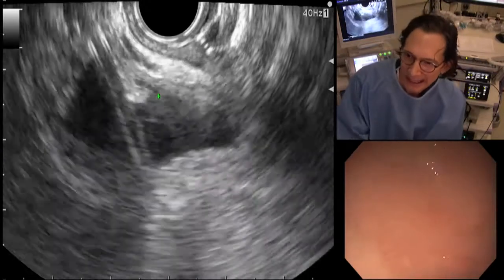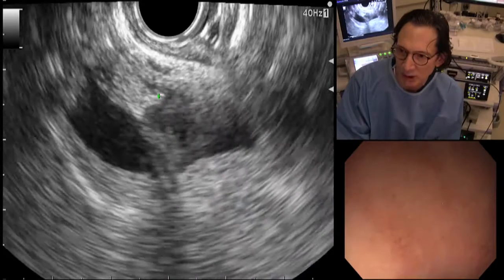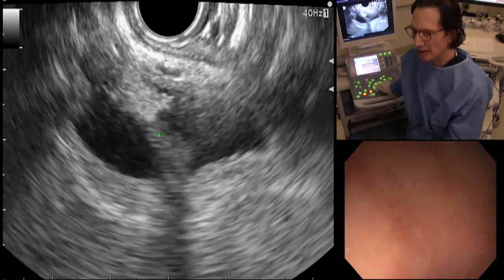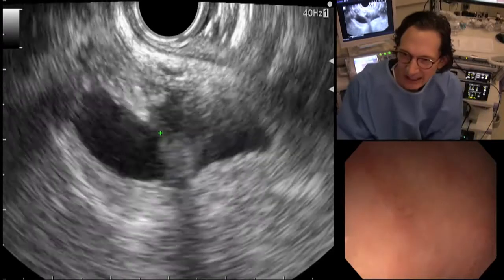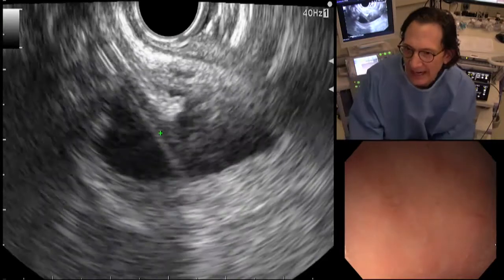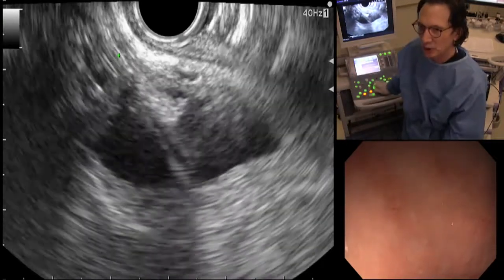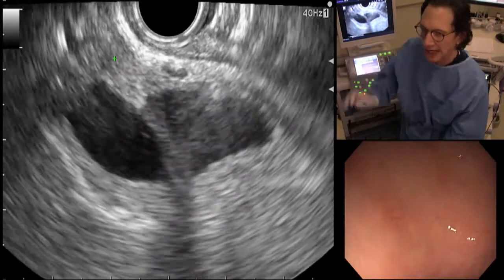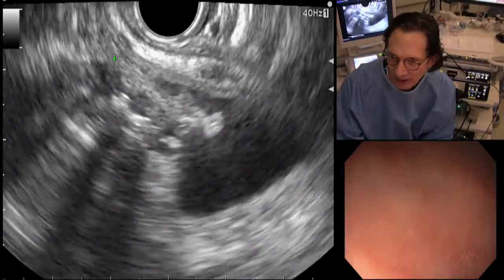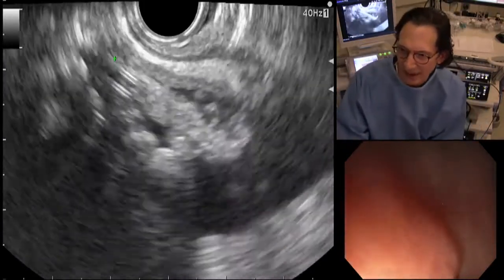So now all the features are looking like gallbladder, and finally we see there's a tube in there, right? We see a double tram track structure here that is consistent with the cholecystostomy tube in the gallbladder. And up here you see it even better. Look up here, see the double tram track? So very echogenic lines that indicates that that is the cholecystostomy tube. So we're getting a better feel for the anatomy now.